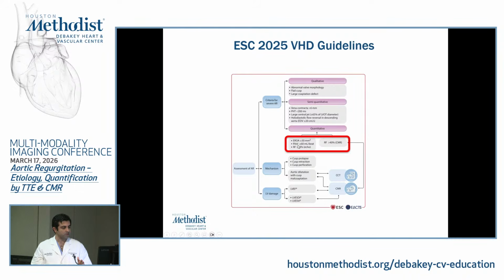In reality, this is just extrapolation from mitral regurgitation data. So when you actually do all the quantitation that I showed you, it may actually be that these values are also a little bit lower in terms of what values associate with adverse events. The regurgitant orifice area is probably solid at 30 millimeters squared.